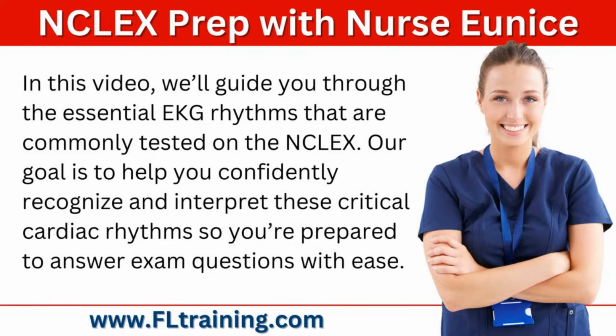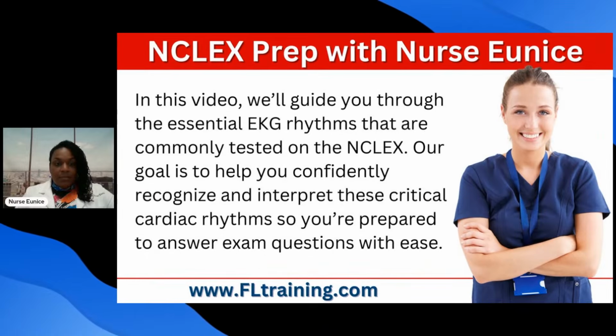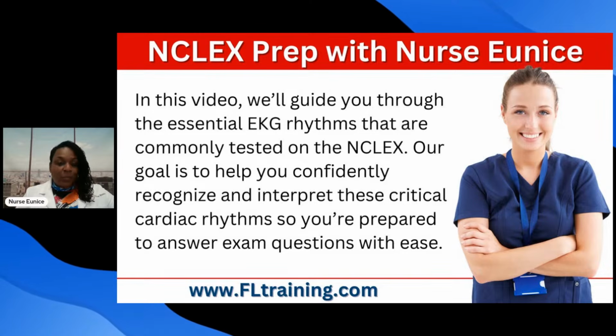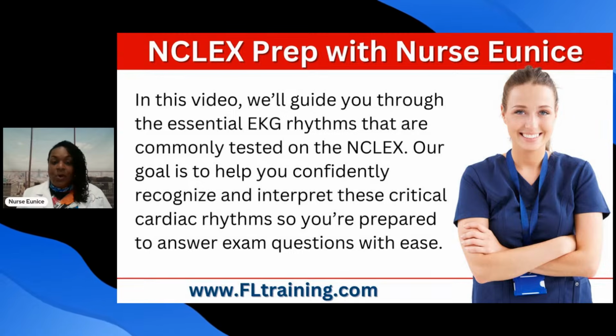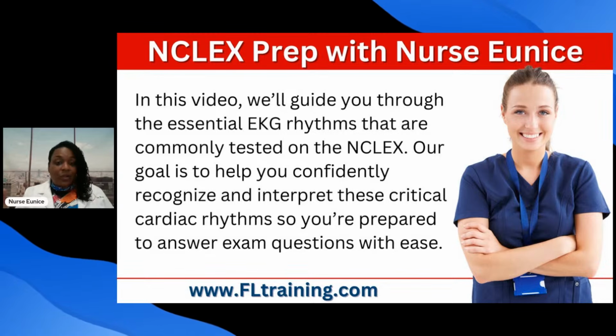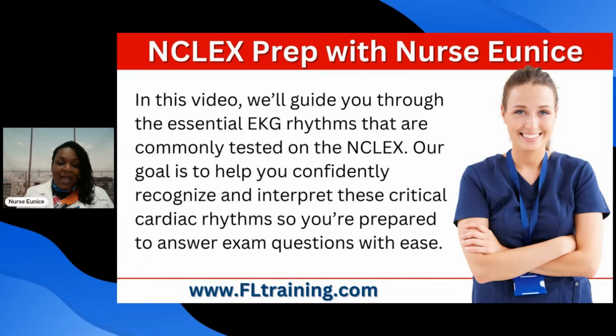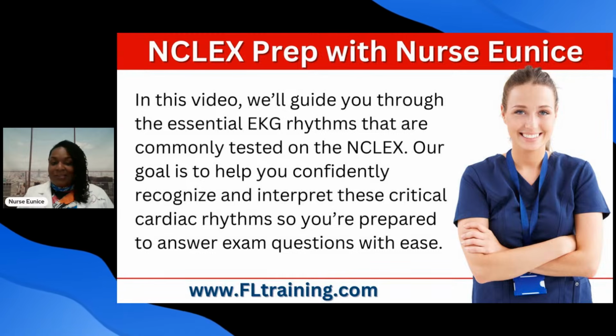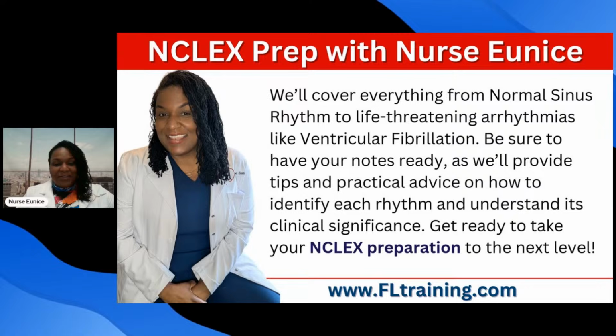So in this review, I'll guide you through the essential EKG rhythms that are commonly tested on the NCLEX, or if you're working in the medical profession. Even if you're a CNA, sometimes you want to know what is going on with your patient. What do those rhythms on the heart monitor mean? So our goal is to help you confidently recognize and interpret these critical cardiac rhythms so you're prepared to answer exam questions and be a more competent caregiver.